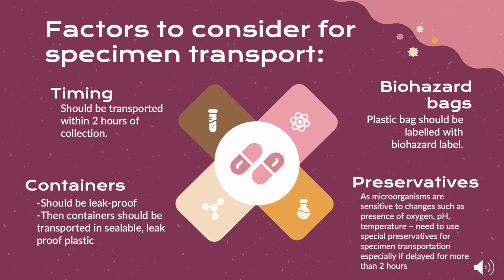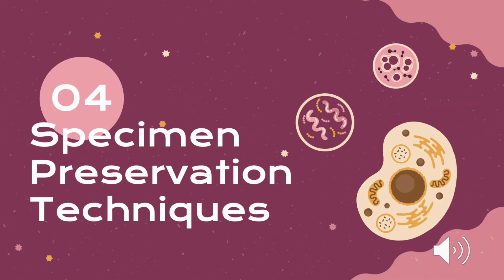Lastly, the use of additional preservatives, as microorganisms are sensitive to changes such as the presence of oxygen, pH, and temperature. There is a need to use special preservatives for specimen transportation, especially if delayed for more than 2 hours.